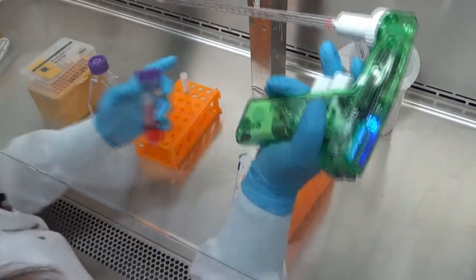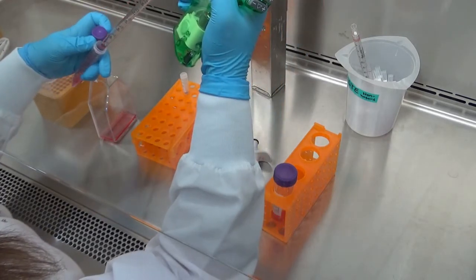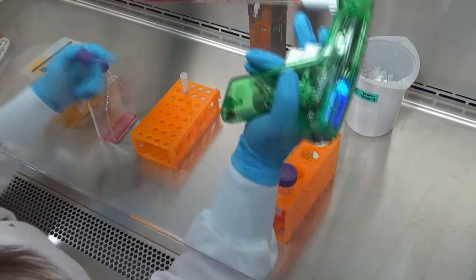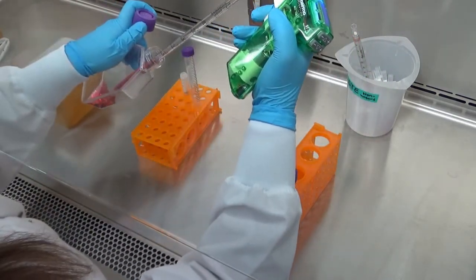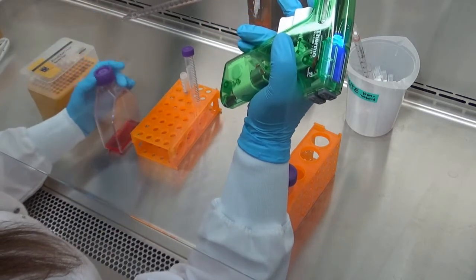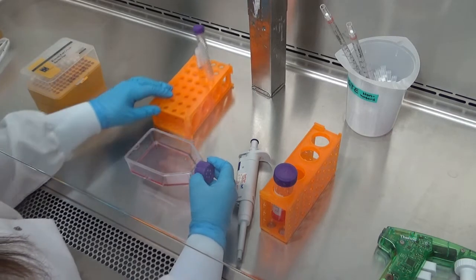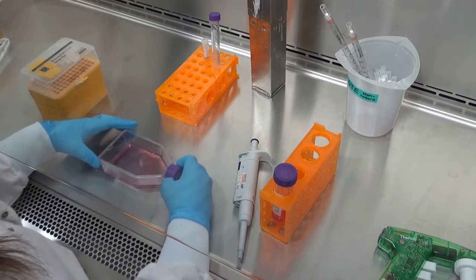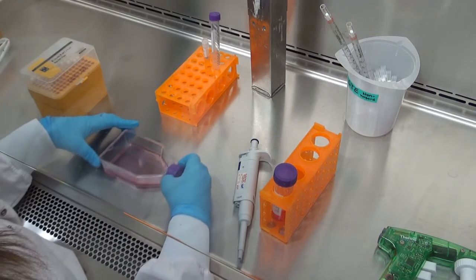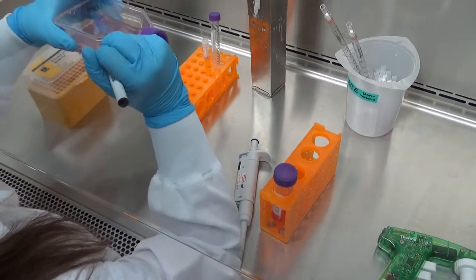Add media directly into the flask first, and then add the cells in. Pipette up and down to mix. Cap the vented top of your flask tightly. To ensure homogeneity, be sure to rock the flask gently in all directions. Label the flask clearly with your initials, the date, cell type, and passage number if available.